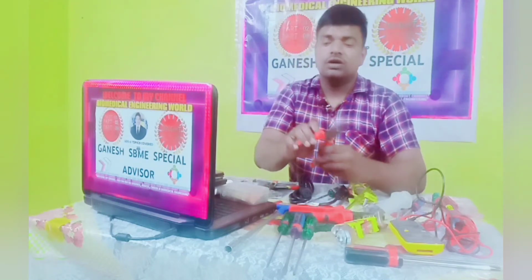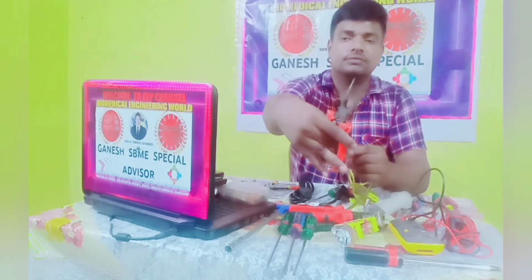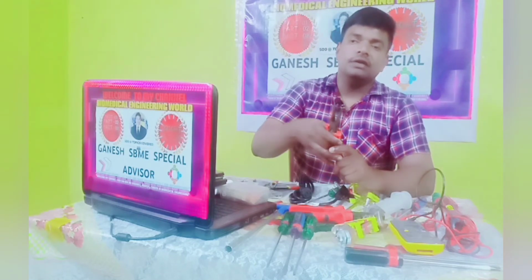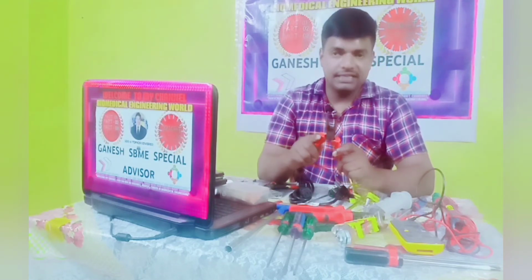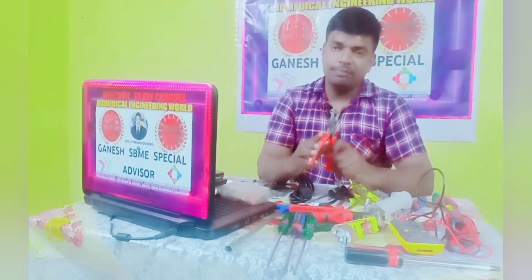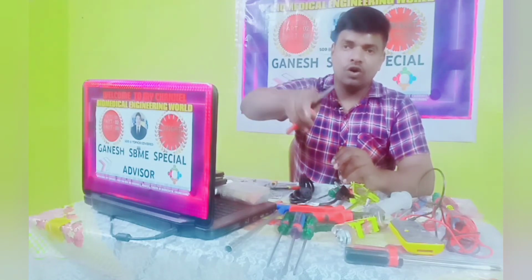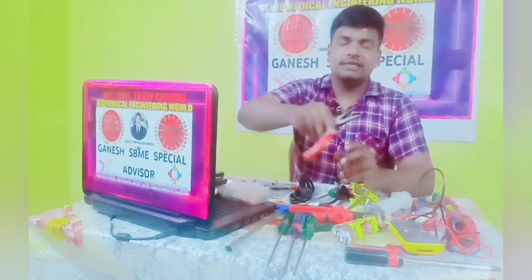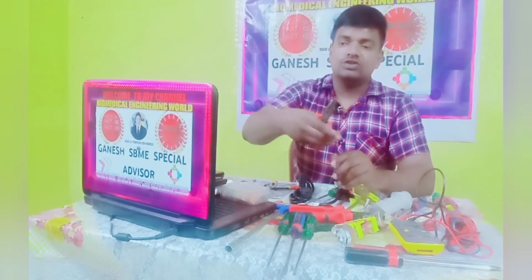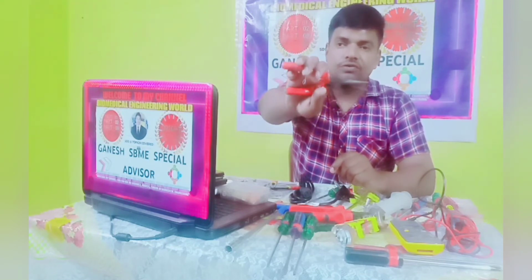And next one, nose plier. See, by using this we can fix patient monitors, ventilators, syringe pumps, BiPAP, CPAP, wherever it is. Sometimes it is used for opening knobs and many things. Sometimes screws are very small and it is not possible to open them, so by using this nose plier we can do the work.